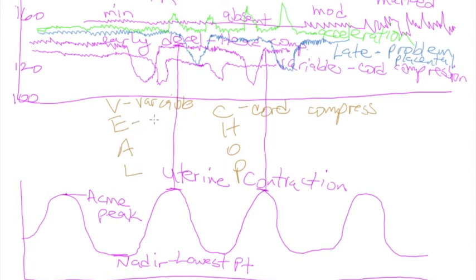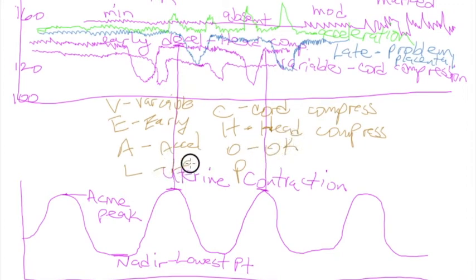When you have earlies, earlies are due to head compression. Remember that? Accels, acceleration. They're A-OK. Lates, remember they're bad. They are placental problems.